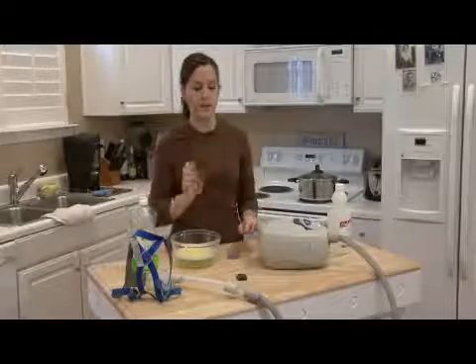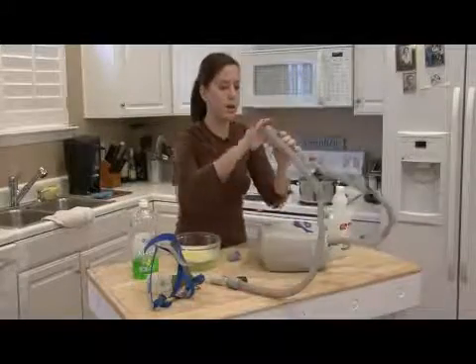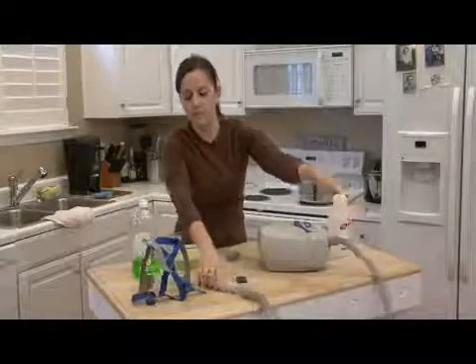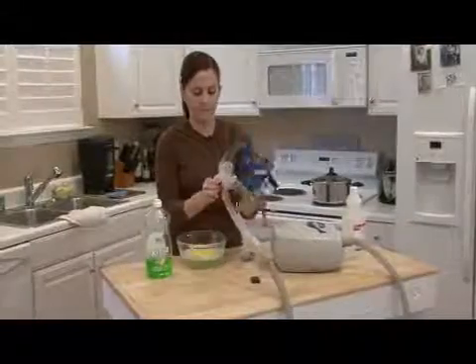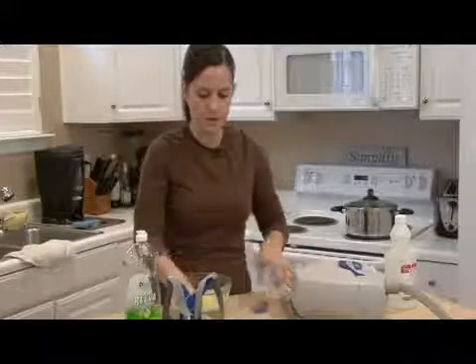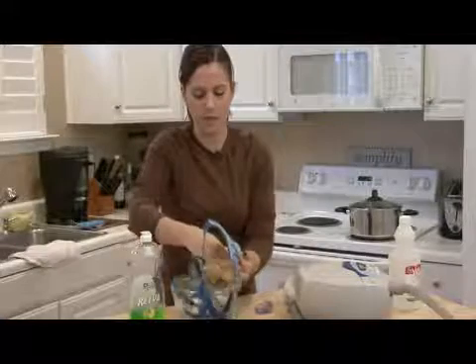Another thing you want to clean is this tube. Best case scenario, you want to clean this every day if you have the time. And all you're going to do is run this soapy water through the tube and then some nice clean water to rinse it out. Same thing with the mask that goes over your mouth. You want to wash it with soapy water. And of course, all these things come apart and they detach. And like I said, with these, you just want to use some really mild soap with water. And you want to rinse them really good.